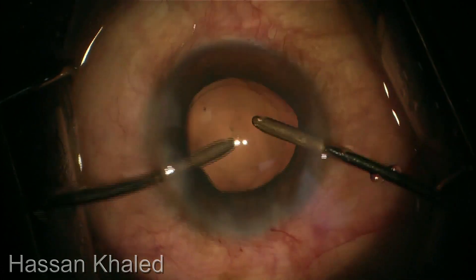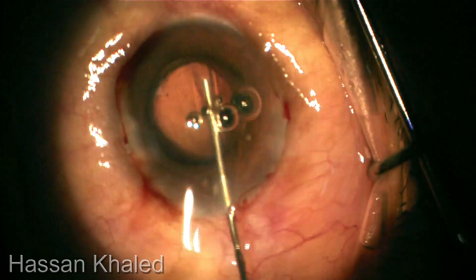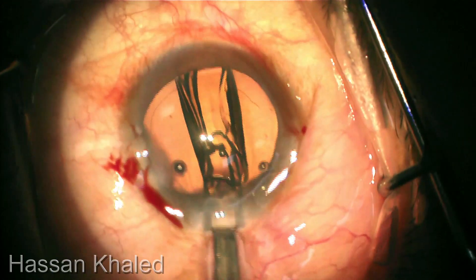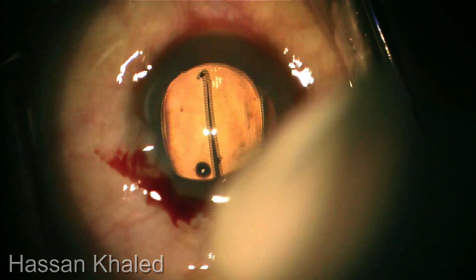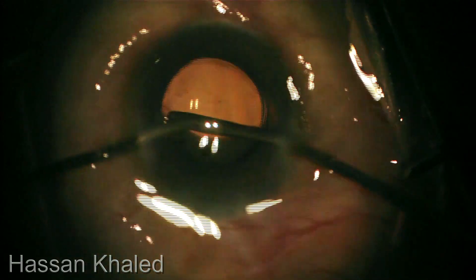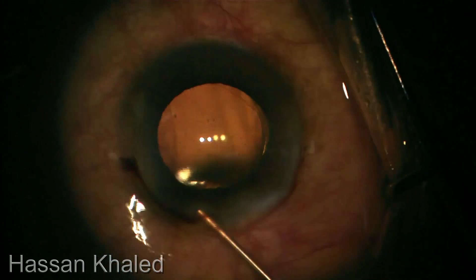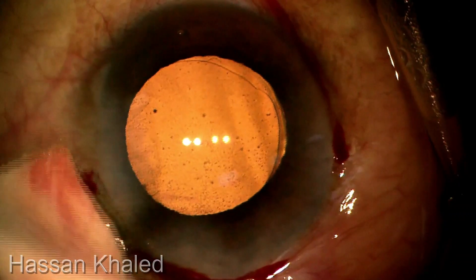Now the cortex has been removed. Then injecting a cohesive OVD to form the capsular bag and implanting a single-piece hydrophobic IOL. It is important to avoid trifocal IOLs in these cases and to avoid hydrophilic or silicone IOLs in these patients. Then performing gentle stromal hydration for the paracentesis and for the main phaco incision.